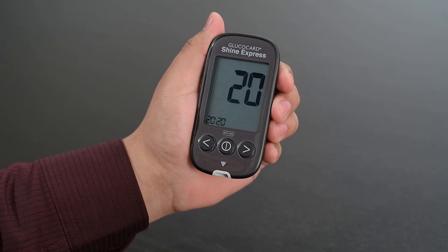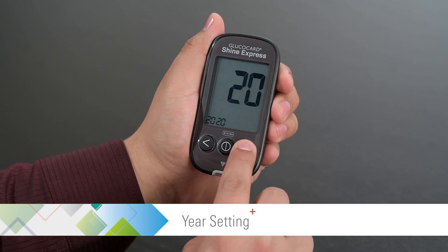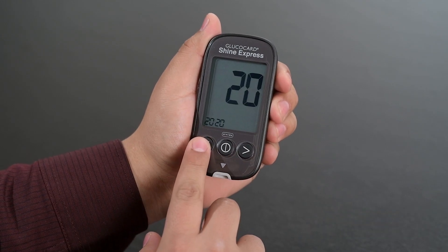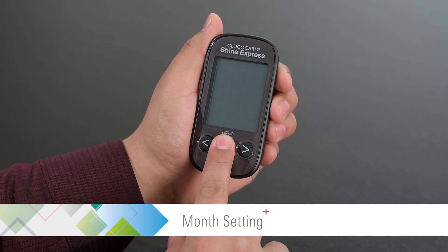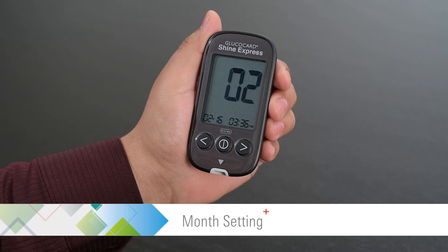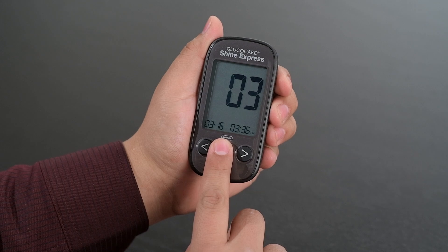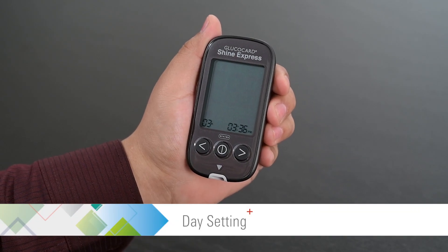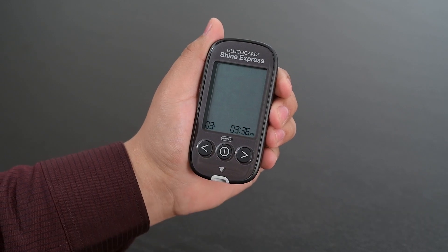Press the center button again to proceed to the year setting. Use the left or right arrow buttons to set the year. Then press the center button to proceed to the month setting. Use the left or right arrow buttons to set the month. Then press the center button to proceed to the day setting. Use the left or right arrow buttons to set the day.